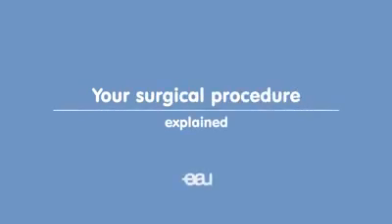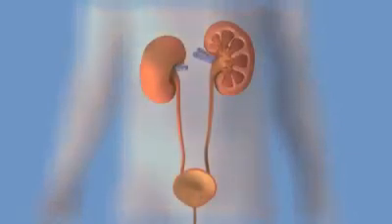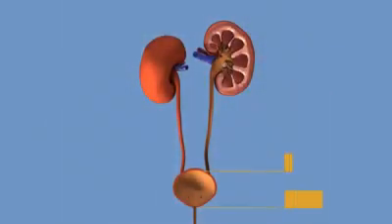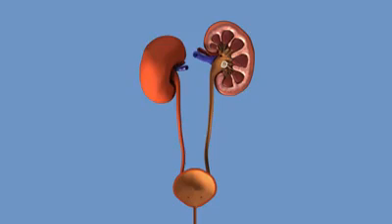Your doctor has recommended that you undergo a ureteroscopy. During this procedure, a ureteroscope with a tiny fiber optic camera is inserted through the urethra and bladder into the ureter or kidney. Ureteroscopy is used to remove kidney or ureteric stones and enables a direct view of the ureter and kidney to confirm or rule out other abnormalities. This animation shows the removal of a kidney stone.